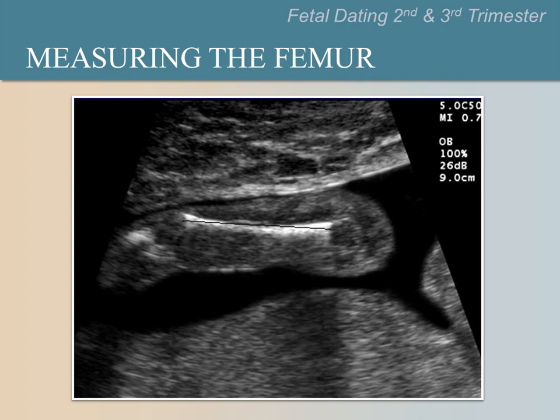Remember that bone is white. Measure the bone only. Do not include the black at the ends. That is cartilage, not bone.